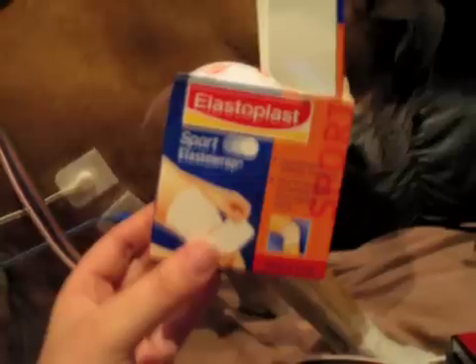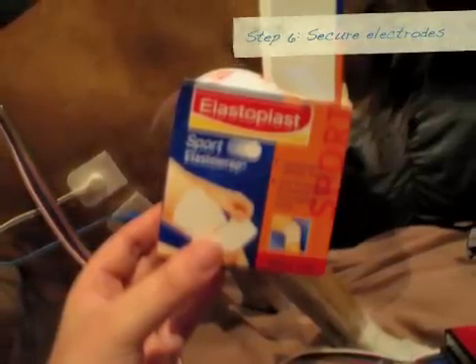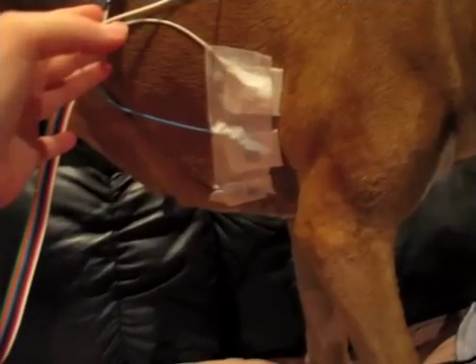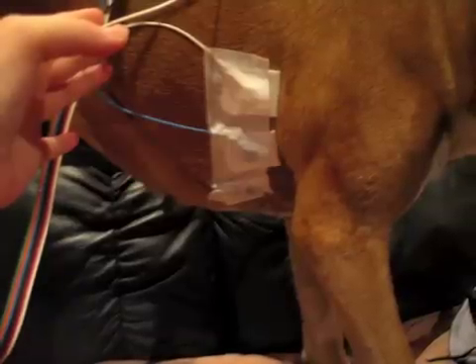They're now firmly attached and now I usually put on a bit of tape on top of the electrodes just to help secure them, to make sure that any tension on the wires doesn't pull them off. I use a hypoallergenic sports tape that I got from a pharmacy. It's got little holes in it so that there's still air getting through to the skin, but it sticks quite well and just keeps the electrodes nicely in place. I usually make sure that the whole area of the electrodes is firmly taped over in this way on both sides.